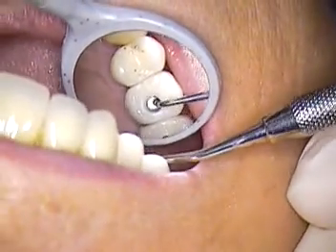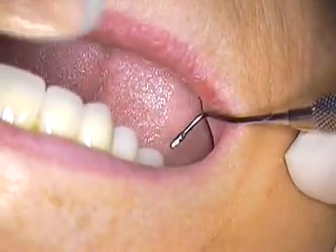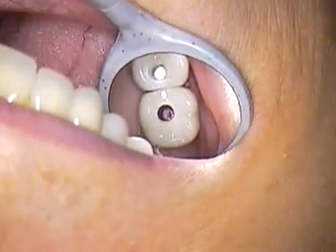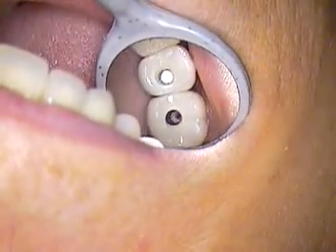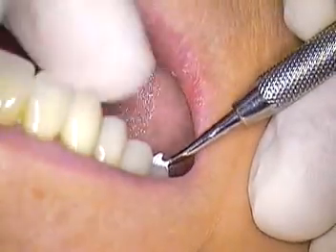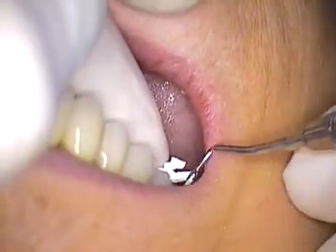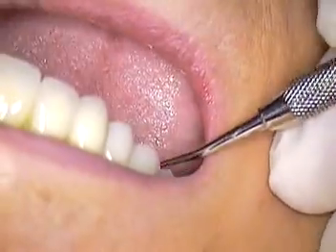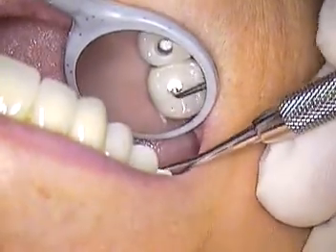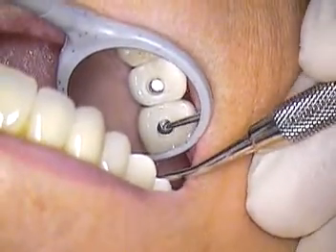So it's no big deal — these are on and will hopefully never come off on their own. But if they ever do come loose because the screw's loose, we've got access to it. It's easy. If you fill that hole up with just composite without doing this, some like to put in wax. I don't like paraffin in there anymore — if it gets in a thread, it's hard to get out. You have to steam them, and not every office has a steamer. So Teflon tape works great and it's very condensable.